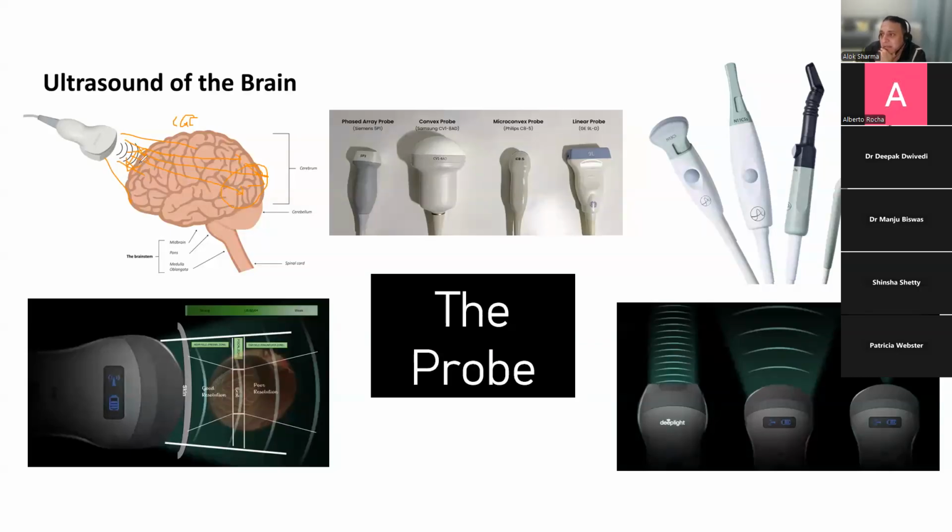And experience usually says that if it's the fontanelle that's the limiting factor in that particular side, use the depth of the fontanelle, but don't hesitate in those situations, if you want to see the deeper areas of the brain like the cerebellum, to use the mastoid and the temporal views or the posterior fontanelle, which will give you better access. So there is a compromise when you're doing cranial ultrasound between using presets and using the manual mode.